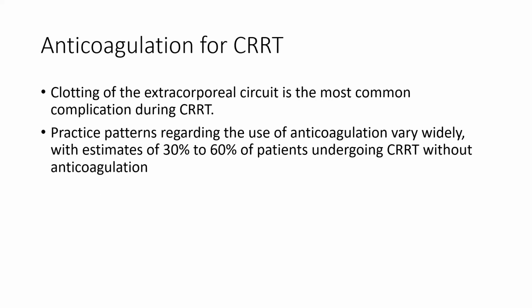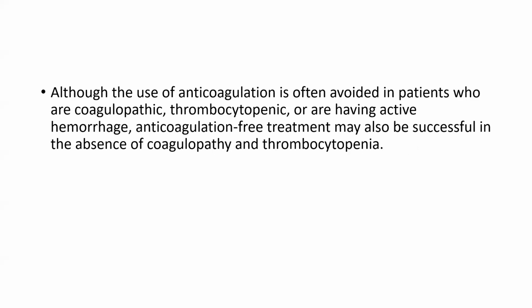Now regarding anticoagulation for CRRT. Clotting of the extracorporeal circuit is the most common complication during CRRT. So the practice pattern regarding the use of anticoagulation varies widely, with estimates of 30 to 60% of patients undergoing CRRT without anticoagulation. Although anticoagulation is often avoided in patients who are coagulopathic, thrombocytopenic, or having active hemorrhage, anticoagulation-free treatment may also be successful in the absence of coagulopathy and thrombocytopenia.